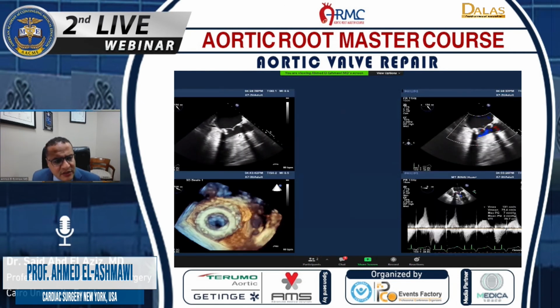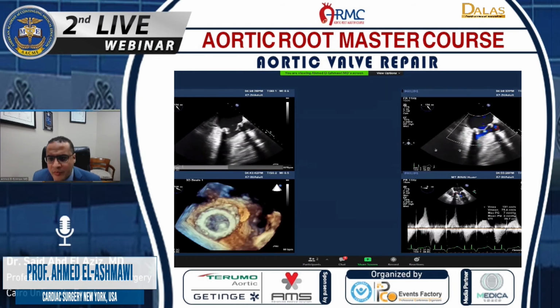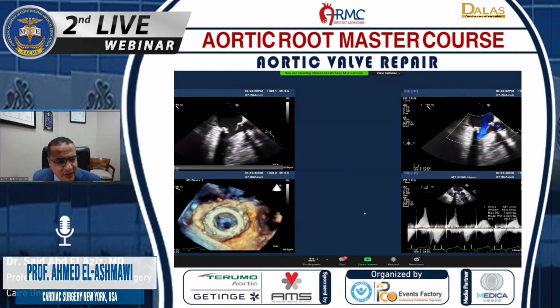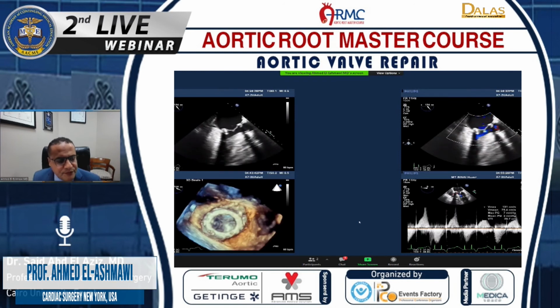So as you can tell, this patient had, from the echo, a very well-seated mitral prosthesis. There was no rocking motion, no paravalvular leak, no gradient. Very good result. Very wide open outflow tract and well-functioning aortic valve. So we thought that that was a perfect anatomical correction for a very complicated problem.